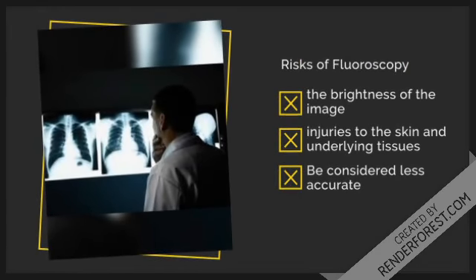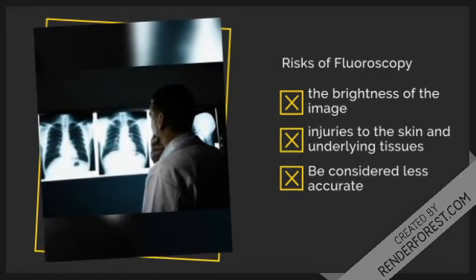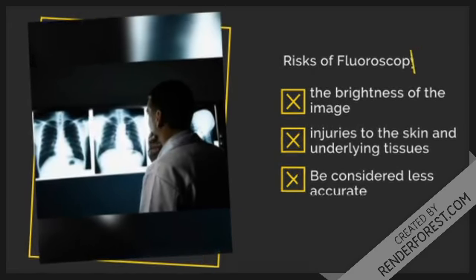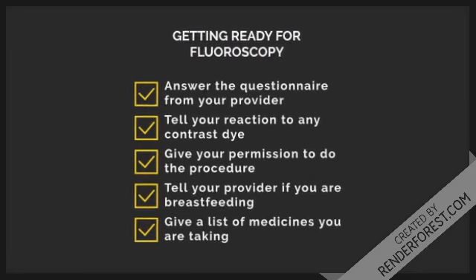These injections can be both diagnostic, to see if there is a greater underlying pathology, or therapeutic, sometimes providing full relief for an extended period of time. Nowadays, it is most useful in guidance for small, very mobile lesions.